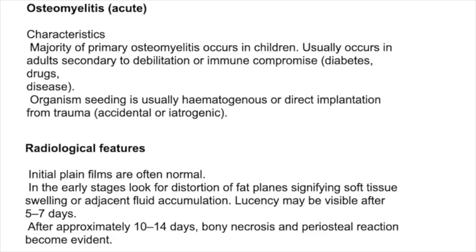You always have to think maybe there is something coming on there. Maybe it's this kind of infection. Always think infection, always think osteomyelitis, like Pott's disease, always think osteomyelitis. So you just follow all the patients, okay? Even the patient that doesn't have fever, follow all the patients. Because the initial plain films are normal, and also there is no distortion of the fat planes, if you have any doubt, you can send that X-ray for a report. Okay, it's also another way to help yourself and the patient. If you have any doubt, just send for comment to the X-ray department.